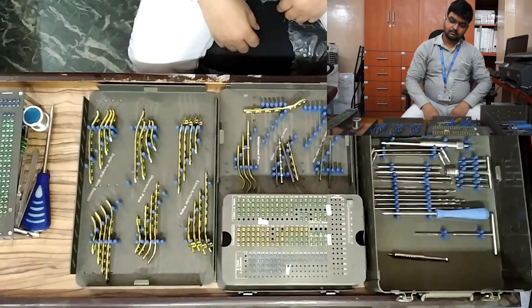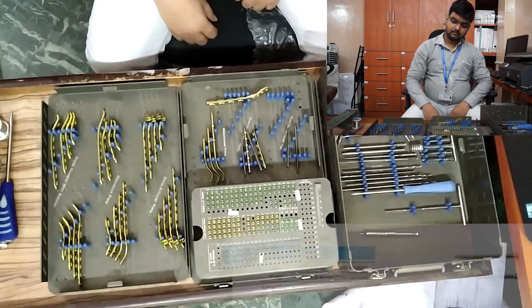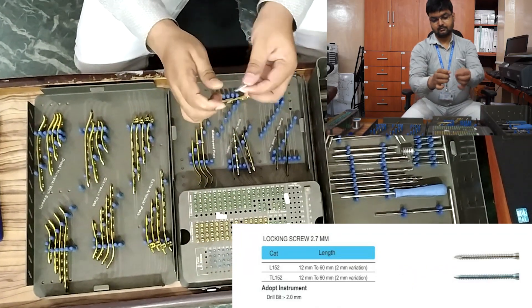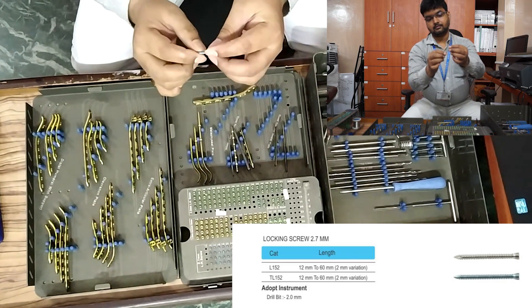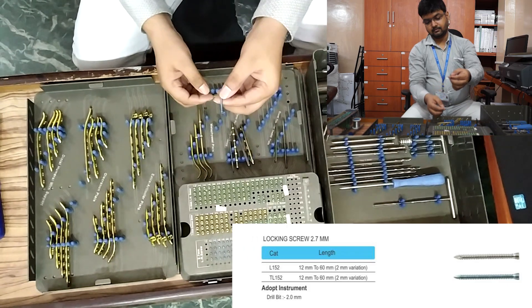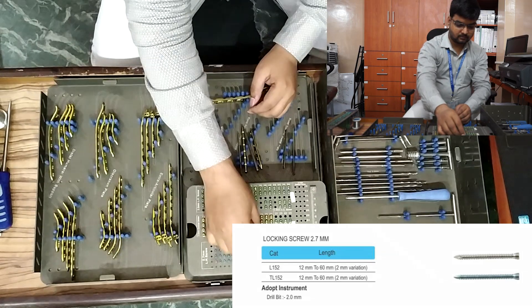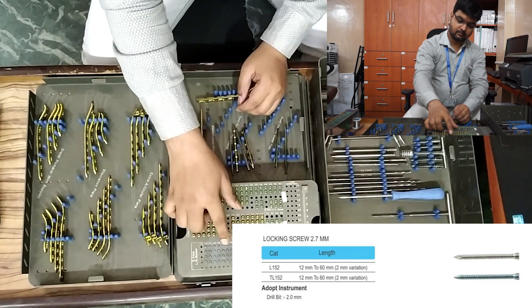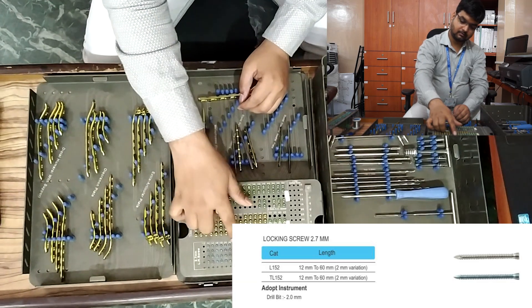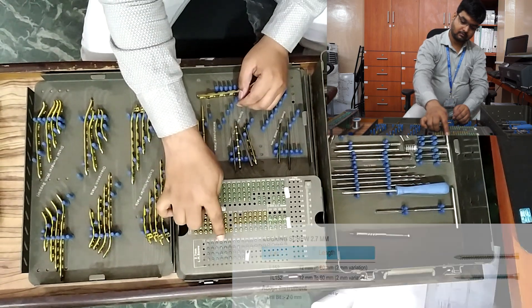Now we are going to come to the screws. First, 2.7 mm locking screw, 12 mm to 28 mm, four pieces each. When we say 12 mm to 28 mm, we have to remember that it comes in a gap of 2 mm — that means 12, 14, 16, and so on.